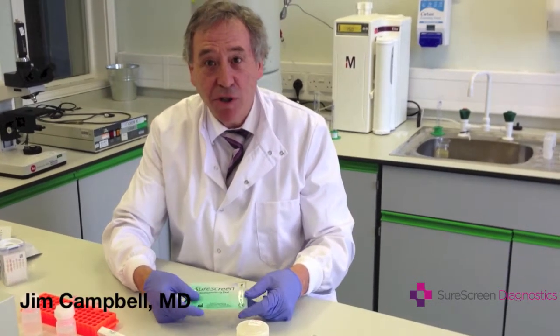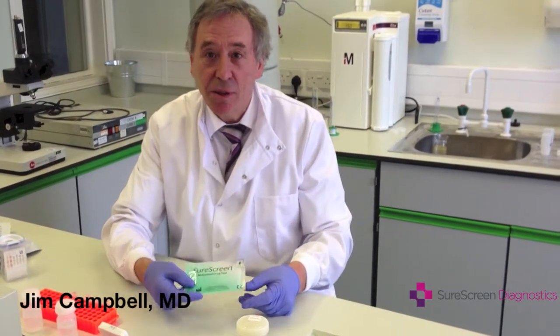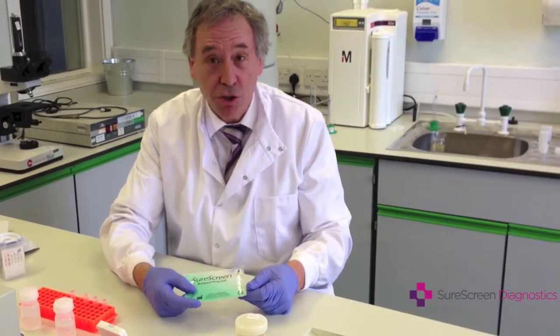Hello, I'm Jim Campbell. I'm going to show you how easy it is to carry out a drug test using the SureScreen DIP card.